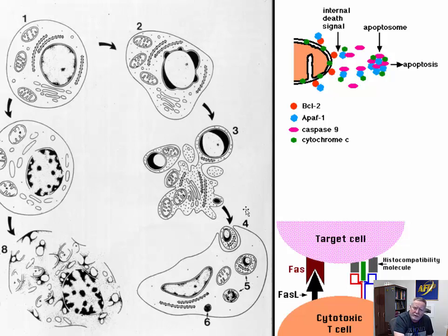Okay, if we're in the lymph node, then we would call these lymphoglandular bodies, and the macrophages, which are resident in the lymph node, that ingest these, would be called tingible body macrophages. And the little basophilic dots in their cytoplasm, which is why we recognize them as tingible body macrophages, are actually little bits of effete apoptotic cells.